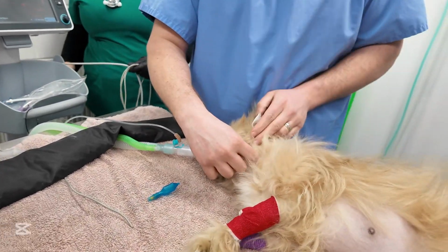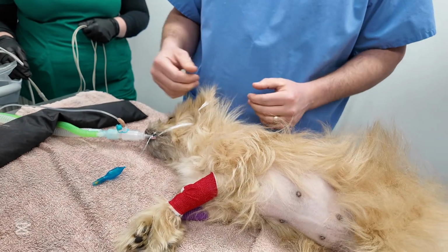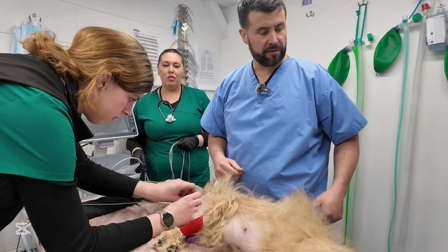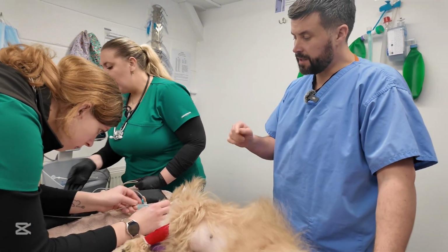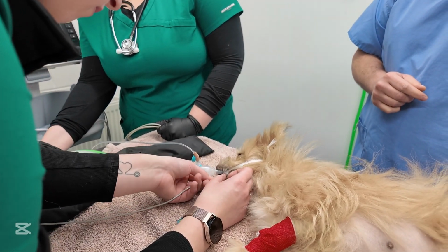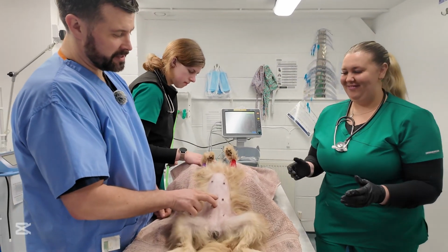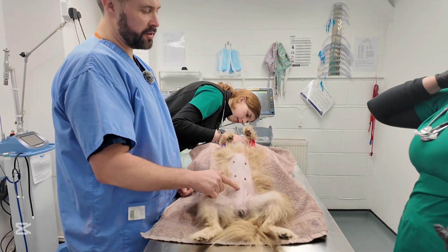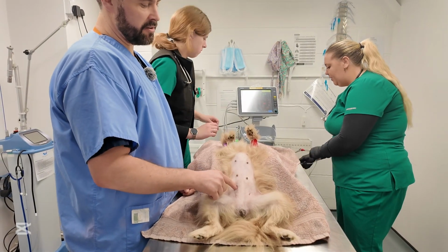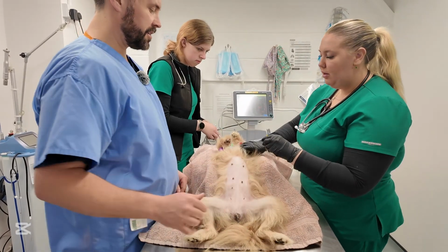If you think mid-neck, that tube will be going down, and the cuff will be inflating around about here. It provides an airtight seal, but also stops the tube pulling back through the larynx. Phoebe there is just placing a thermometer so we can monitor temperature. Also going to add various other monitoring. There you go. So we're going to make an incision here. When you watch the nurses clean, they'll be starting from the point of incision and working outwards, so you don't drag any bacteria back onto the surface that you're going to incise through.